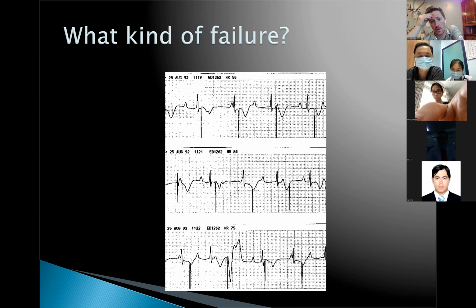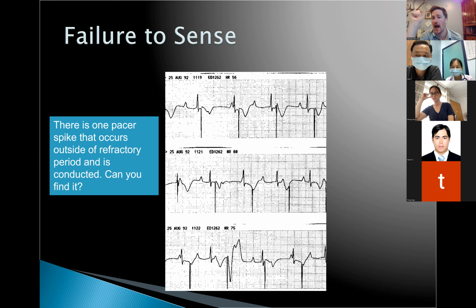So, yeah. But just know that if you see pacer spikes and you don't see a QRS afterwards, and it appears within a patient's other QRS or ST segment, then think about failure to sense. Because if it's in that refractory period, which is inappropriate, they're not going to conduct, and it's not a failure to capture. It's because the patient actually can't depolarize and have a ventricular contraction during that refractory period.